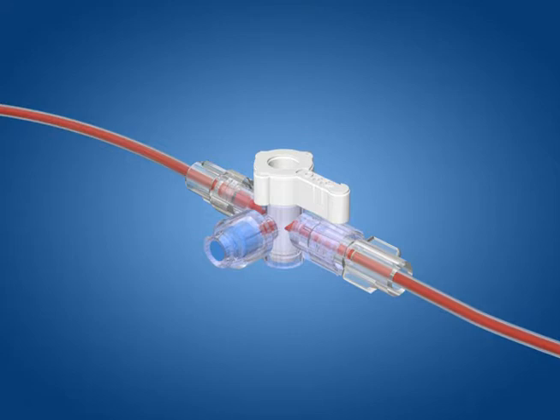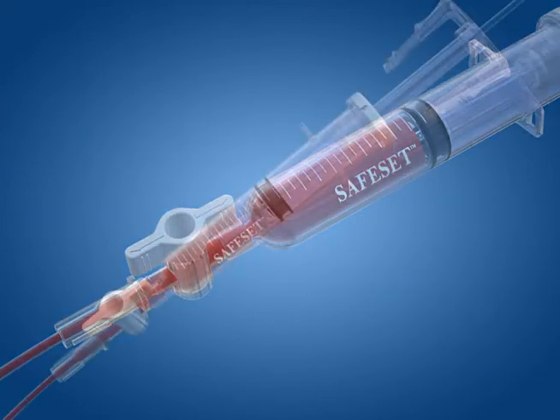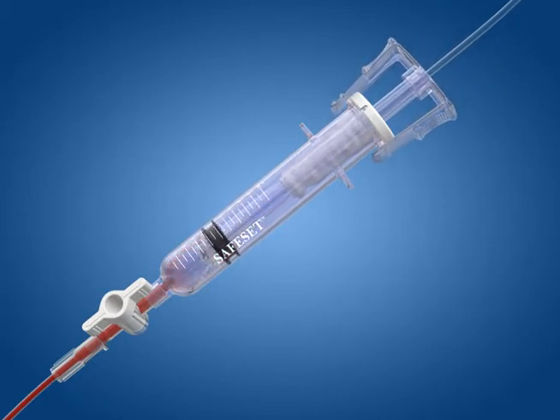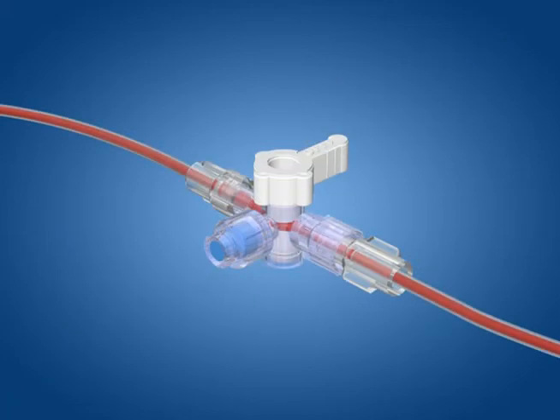Once the sample has been obtained, turn the handle on the swappable valve so it is oriented opposite the valve. Re-infuse the clearing volume contained in the SafeSet reservoir by slowly pressing the plunger until the locking clips lock onto the slots on the reservoir barrel. Then activate the flush device at the transducer until the line is clear of any residual blood.